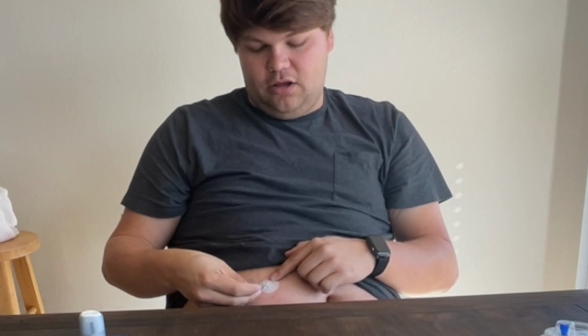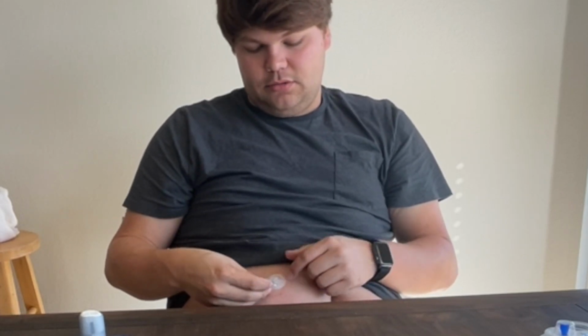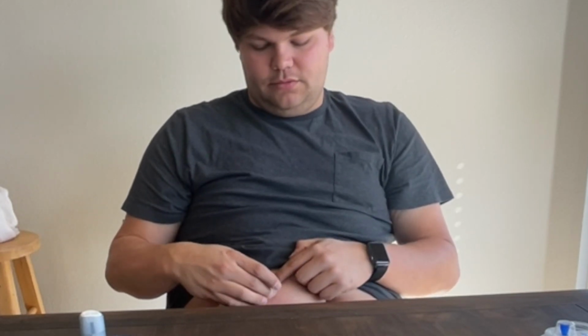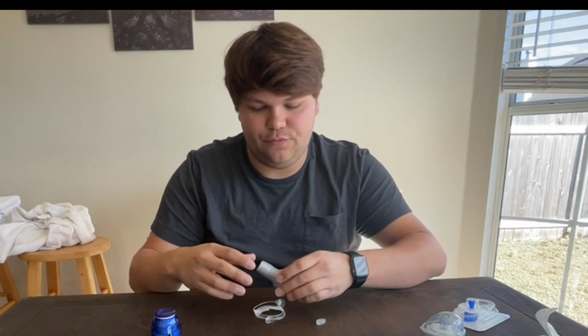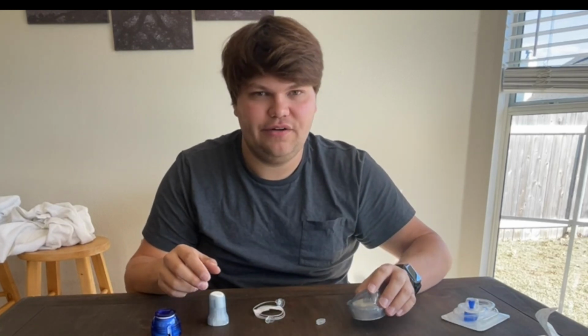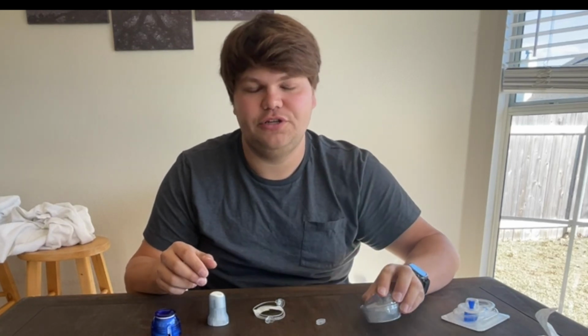This is a little keeper on the tip of the hose. Pull that off. I'm going to get my reservoir set up, connect it to my tubing, prime it, and then all my tubing will just clip right there, and I'll have my pump. So that's the Mio Advanced. I like it because the infusion, everything is all in one package, the same with the original Mio. However, I believe these are going to eventually be discontinued once supply can meet the demand for the Mio Advanced.